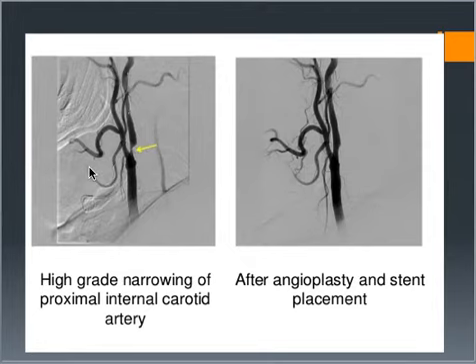So this first one, that patient has narrowing or stenosis, and then after angioplasty, where they put a stent in, you can see how they've opened that back up. Now you can see, due to the contrast, the idea of what the blood flowing would look like.